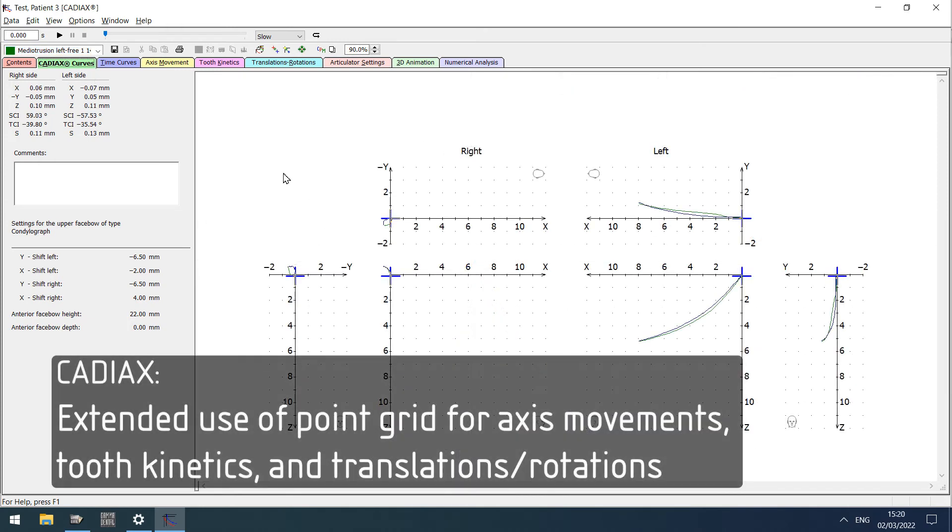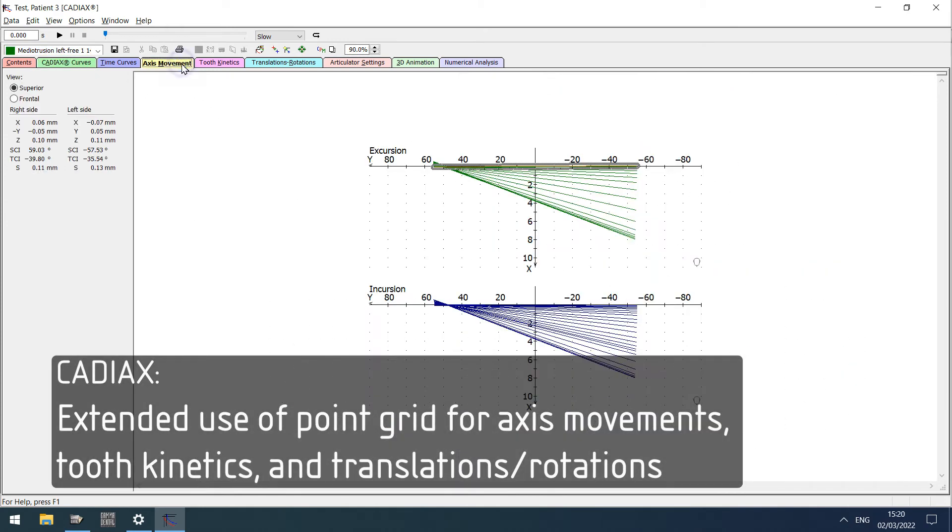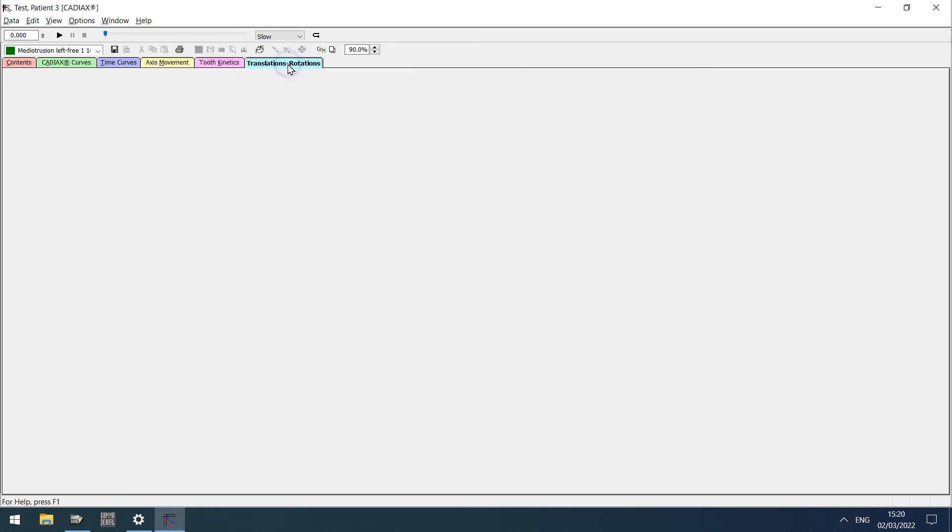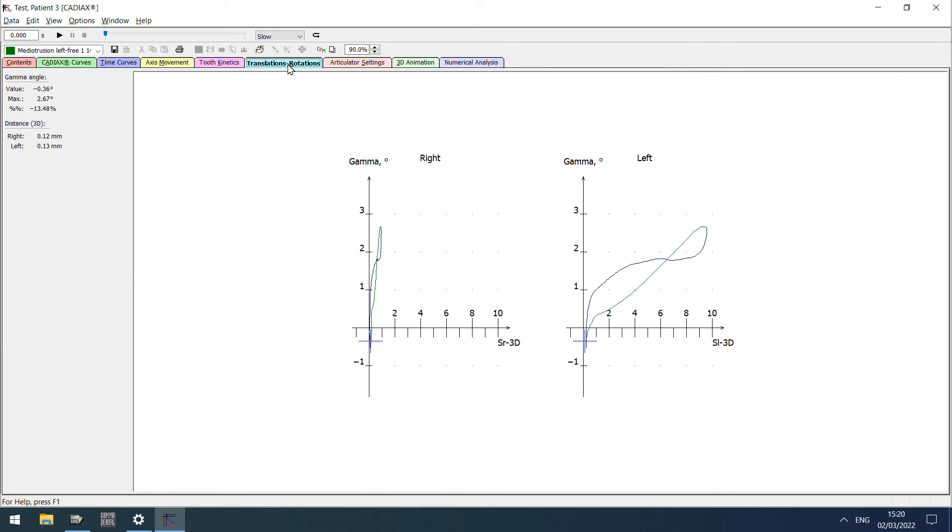The graphics showing axis movement, tooth kinetics, and translations or rotations in Cadiax Analyzer now provide a point grid to improve readability.